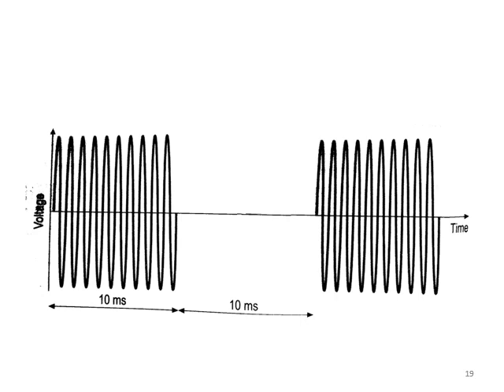As you can see in the diagram, the horizontal line is the timeline, the x-axis, and the y-axis shows the voltage, and the sinusoidal wave bursts can be seen. The duration of the wave burst is 10 milliseconds followed by 10 milliseconds rest. So a single on-off cycle covers a total of 20 milliseconds, and 20 multiplied by 50 covers 1000 milliseconds, equal to 1 second. That's why the currents are 50 Hertz frequency current with 10 milliseconds on and 10 milliseconds off time.